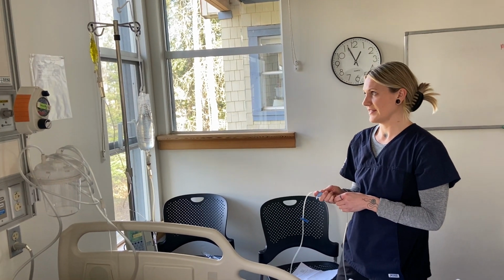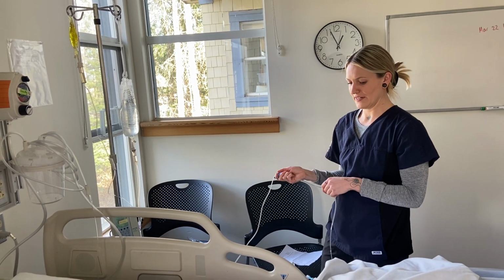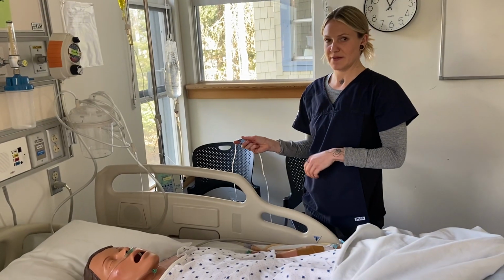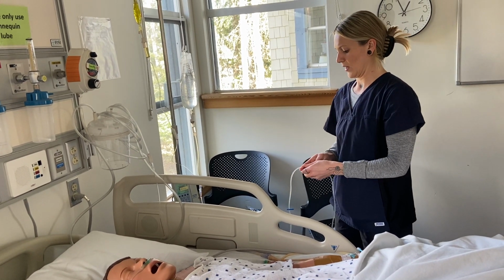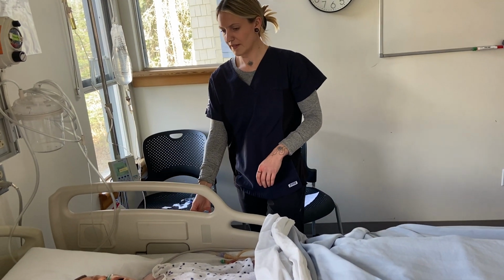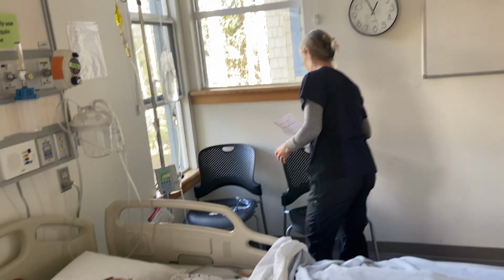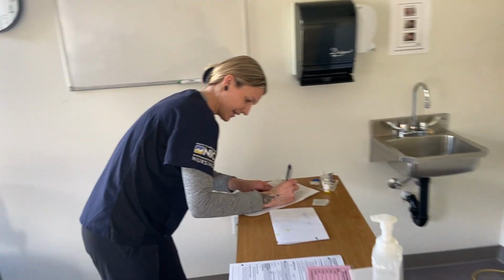And it's been 30 seconds. Okay. So now my infusion is going, and I will tell my patient Jen that I will be back in 20 minutes to check on you when this is finished and just to ring the bell if there is any feeling of discomfort or feeling unwell. Okay. And then I will grab my MAR and sign that I've given her the medication.